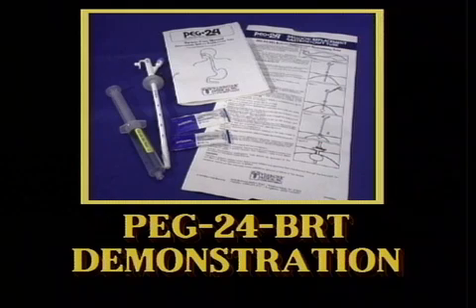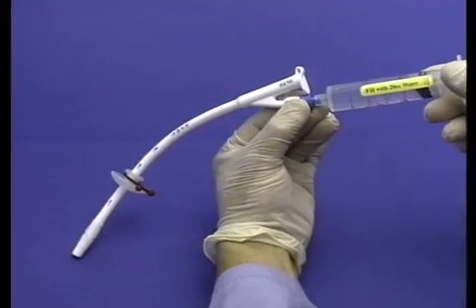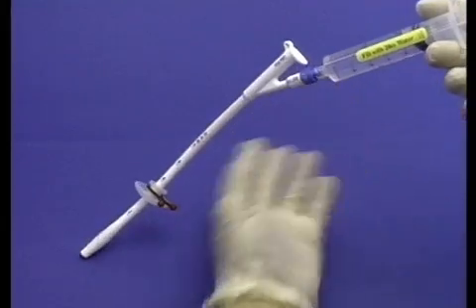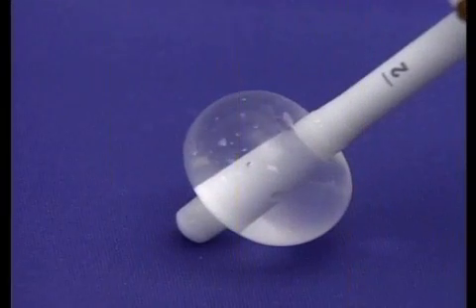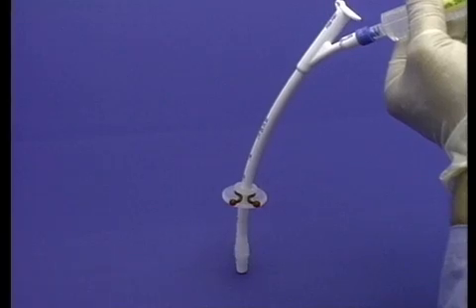We will next demonstrate the use of the PEG24-BRT. After removing the PEG24 silicone balloon replacement gastrostomy tube from the package, inflate with 20 cc's of sterile water. Then completely deflate after inspection.